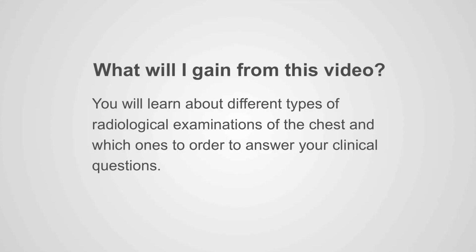What will I gain from this video? You will learn about different types of radiological examinations of the chest and which ones to order to answer your clinical questions.